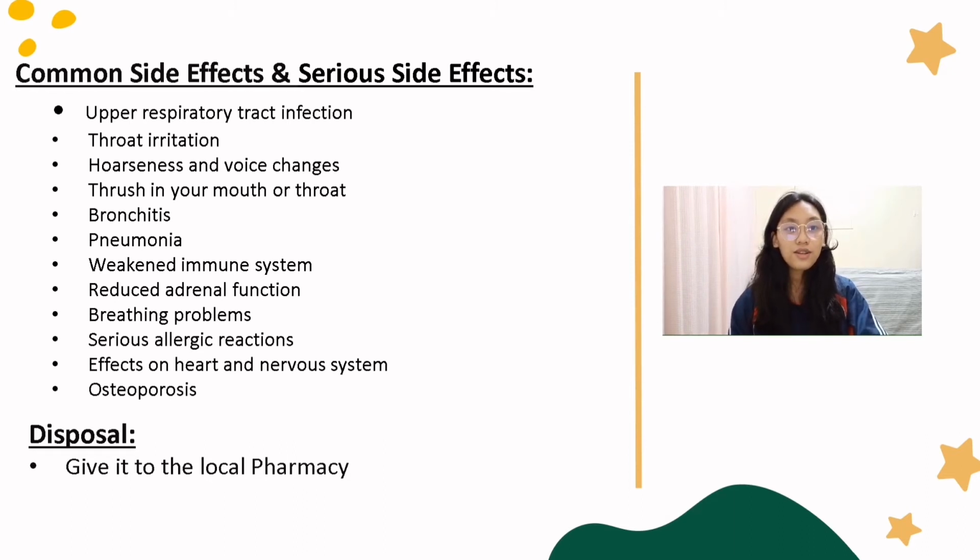When your discus inhaler is already empty and you need to dispose of it, the easiest way to dispose of the inhaler is by giving it to the local pharmacy, since it is considered a hazardous waste.